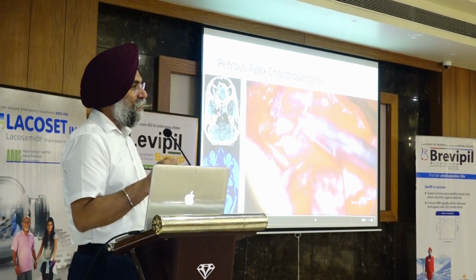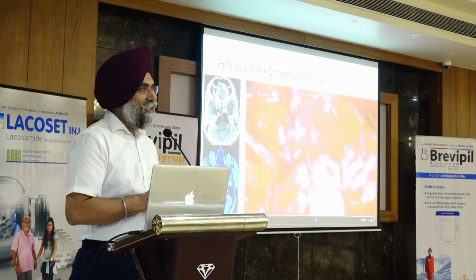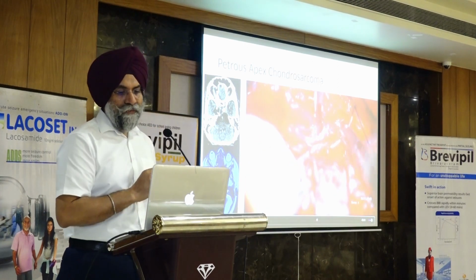You should not be very manipulative there. If you are manipulating there, sometimes that sharp edges can injure the ICA. So very carefully you have to just take them out.